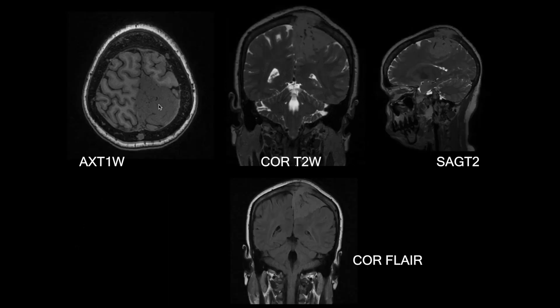There is an extra-axial lesion which is T1 iso-intense, T2 iso-intense, and slightly hyper-intense to adjacent gray matter. There are multiple flow voids in the lesion, and the lesion is causing compression over the adjacent frontoparietal gray matter, with extension of the lesion into the adjacent bone and extra-cranially into the scalp.